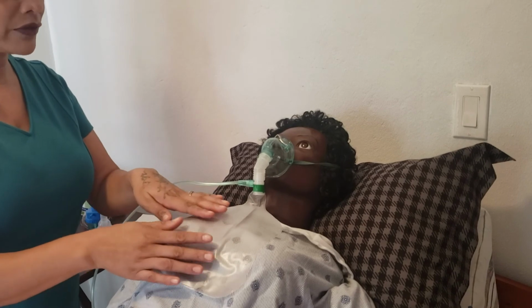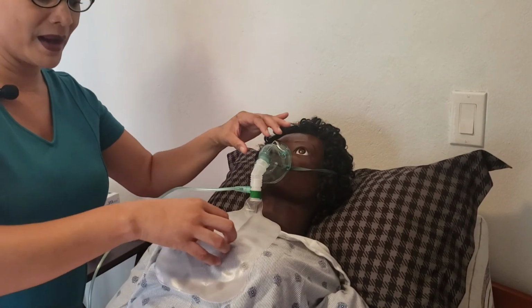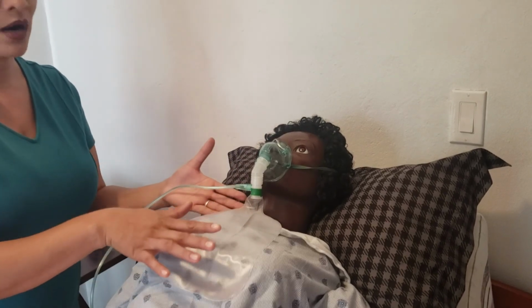So if you ever see your patient breathing in and your bag doing the opposite, then you know that you are going to have a problem and you're going to have to check if the tab is there. And your bag is supposed to never be completely deflated like this.